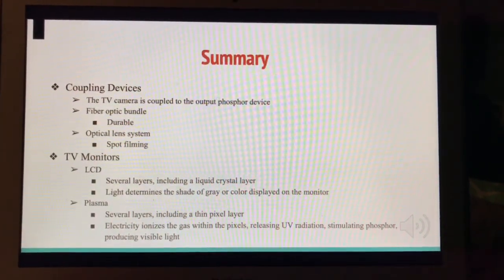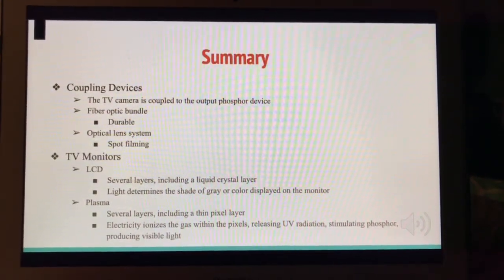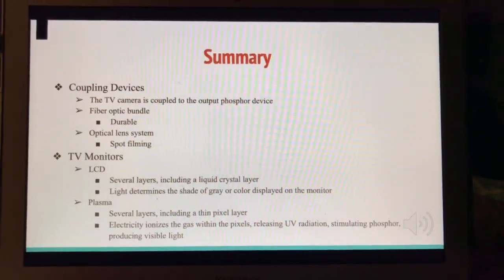The viewing system is important to fluoroscopy, as that is how the radiology team is able to see the anatomy being imaged. Hopefully this video has helped you gain a better understanding of what goes into being able to view an image taken under fluoro.